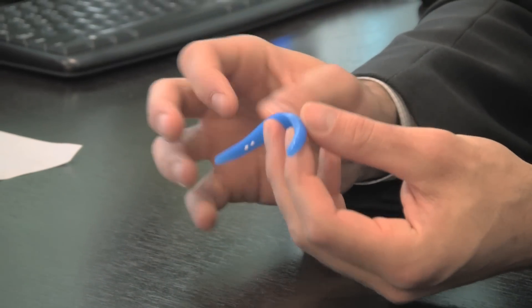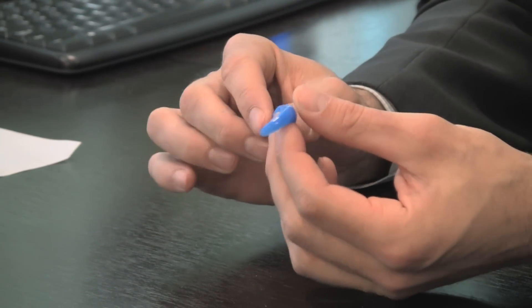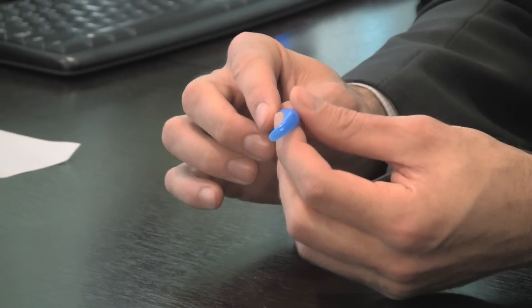The chin implant is a solid material. It's made out of solid silicone, and it has enough density and strength to actually physically move the soft tissues of the neck forward. So this is an example of a chin implant.